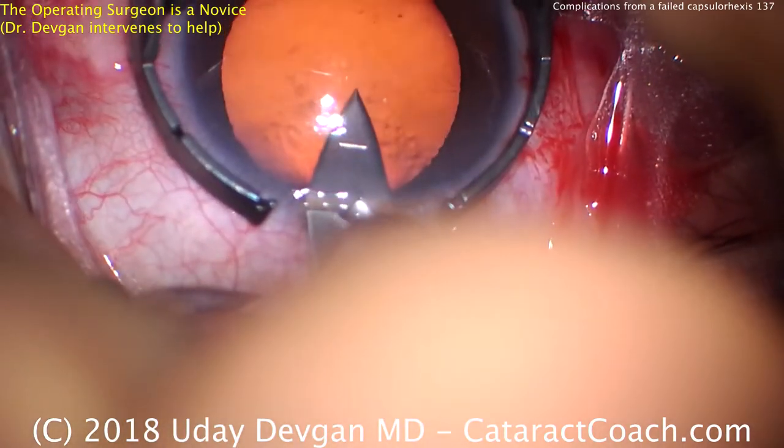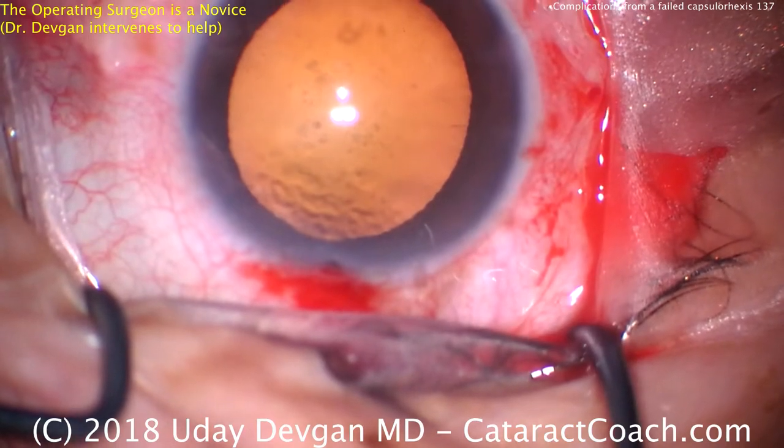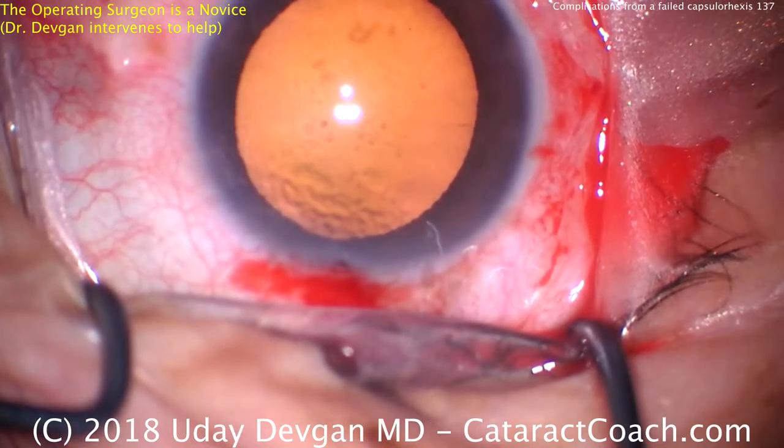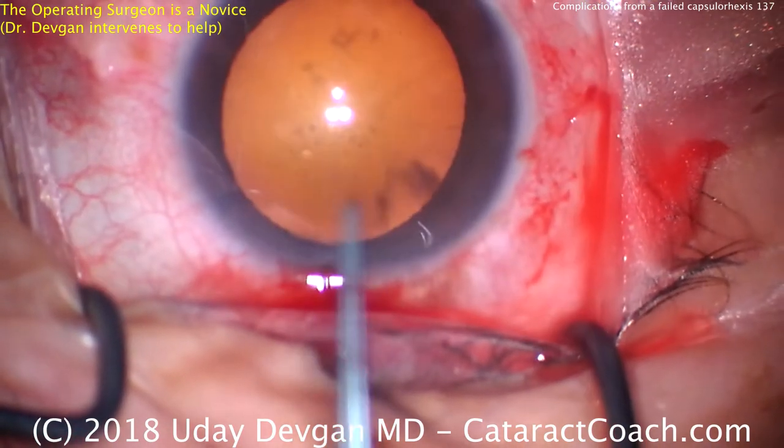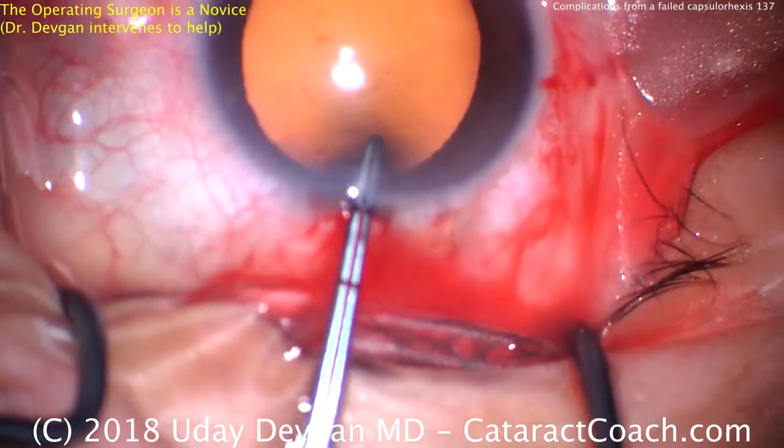It's Kyder at Coach.com and this is a very interesting case. This is a case done by a novice surgeon and we're going to run into some serious complications here. The complication is going to happen right about now. Watch carefully.